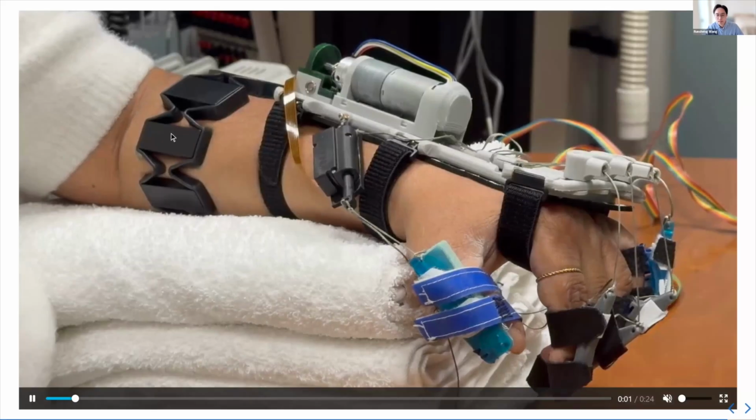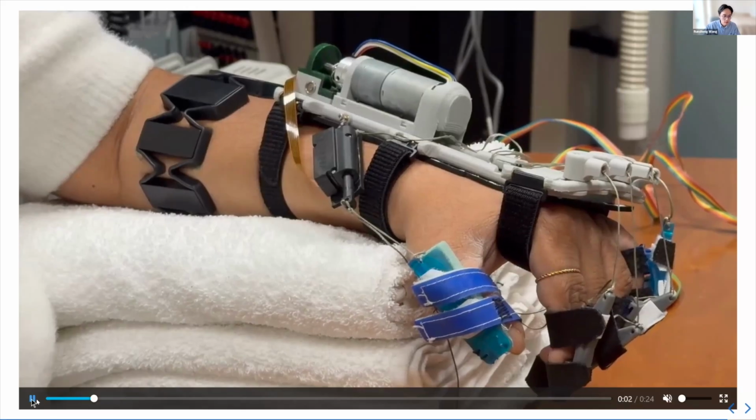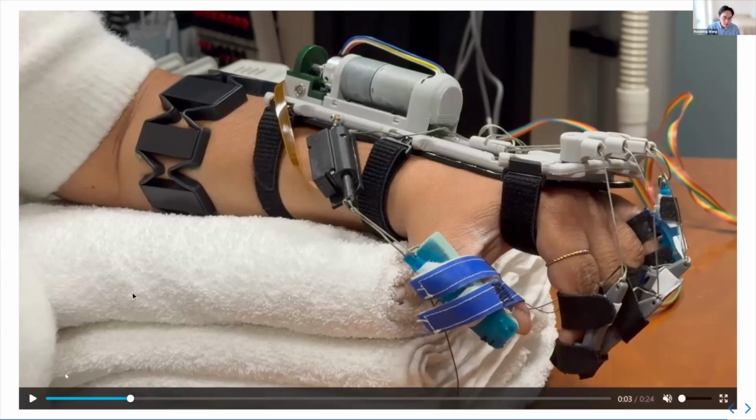And on stroke, what it looks like is as follows. So you can see in the video, the person, let me actually pause this for a second. The person starts in this resting state. The person is asked to open his or her hand. And I want to pause right here. This is at most how much the person will open his or her hand. And this is what I mean by spasticity and stiffness and this clenched fist position that's commonly seen in stroke. So the person, despite keep on trying, she's not going to open her hand because that's how much it will go. But the EMG sensing is on so that the intent is being detected.